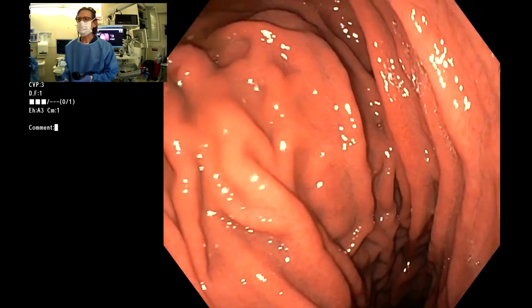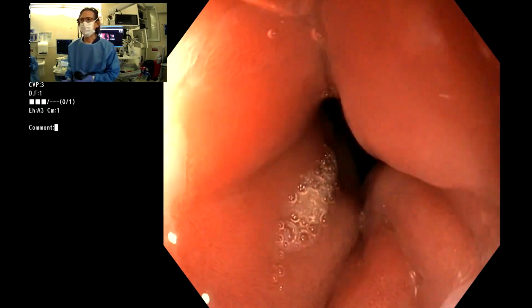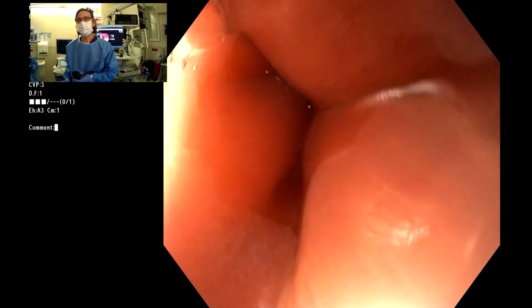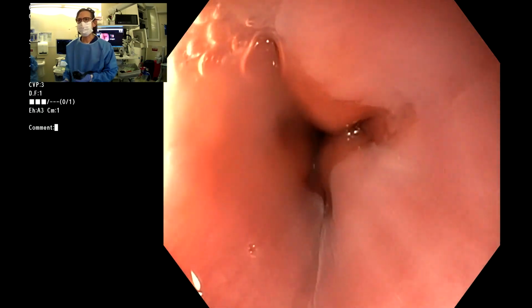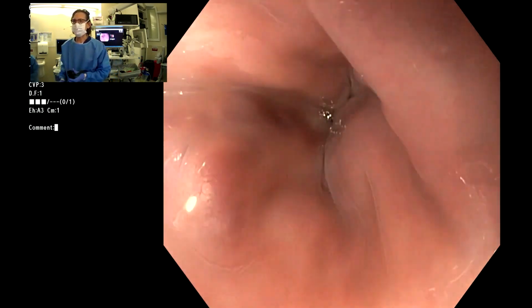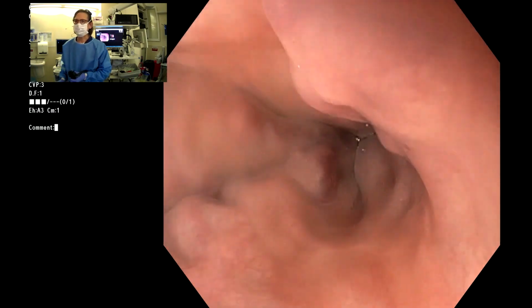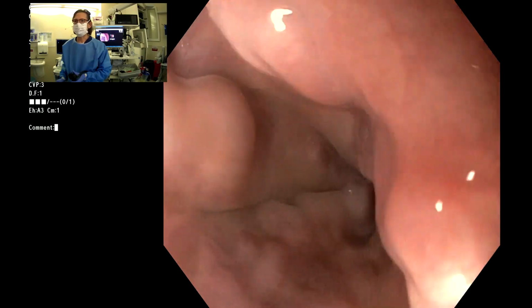These are just rugal folds. They do not look like varices. And if we pull back to the GE junction and cardia, I don't really see varices here either. So I don't think she has junctional varices. But she does have esophageal varices that were banded, and we can see some of that here. So there's still grade 1 to 2 esophageal varices that deserve additional treatment.